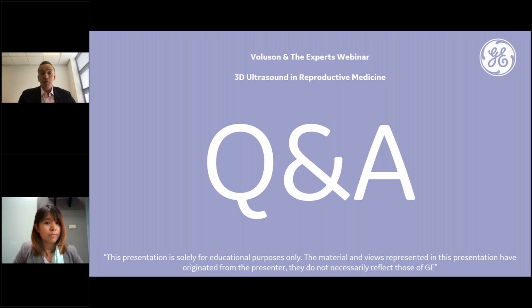But if you've only been scanning for a year, you've got it in front of you because you just apply the images. So it doesn't necessarily mean rendering or multiplanar view. It could be TUI, but acquire the volume, a big broad volume, and then you can flick between those different image displays very quickly, and I think it will come out very straightforward where the position is.